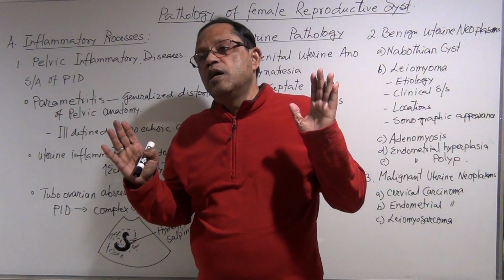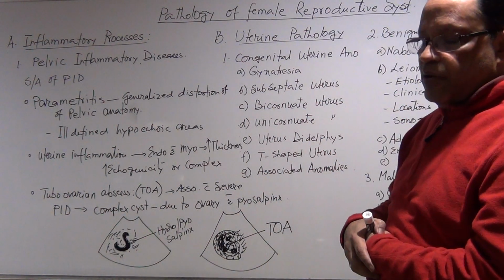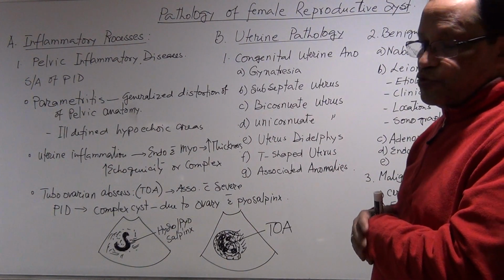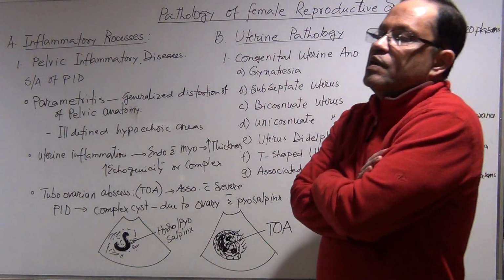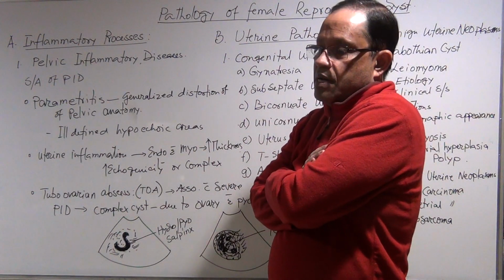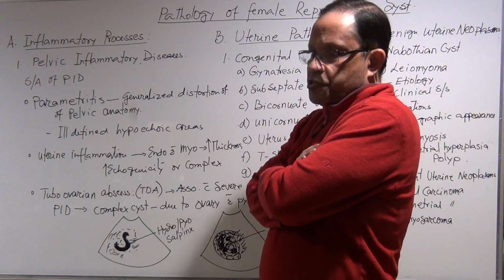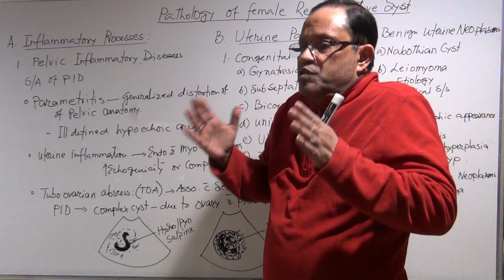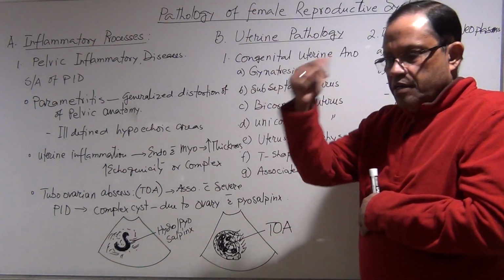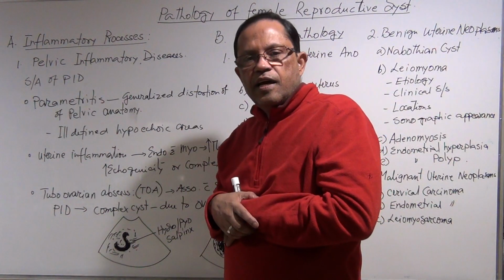Okay, so make sure you see more patients like this in our society, in our chamber, in our examining room, in our lab. So more questions will be in the board exam. You have to understand what the sonographic presentation would be. Do I need to take the history? Oh yes. If you take the history, you will see half of your diagnosis is done. Then the rest matches with the blood report and the sonographic view. You will see your diagnosis is there, and you will be a good sonographer.